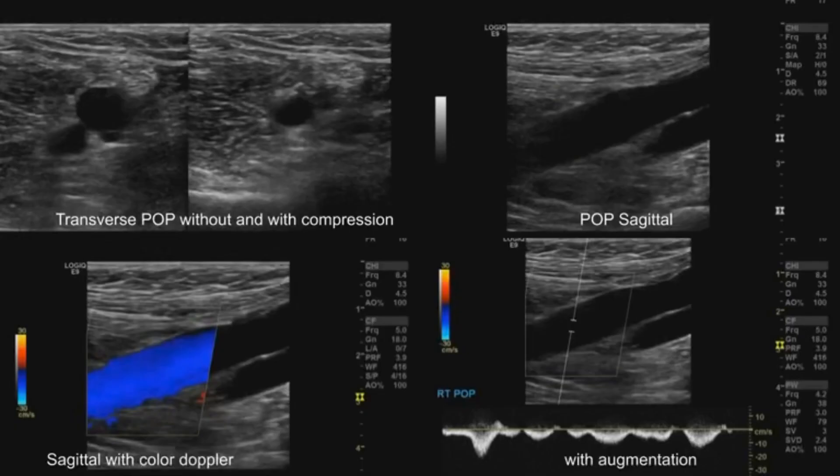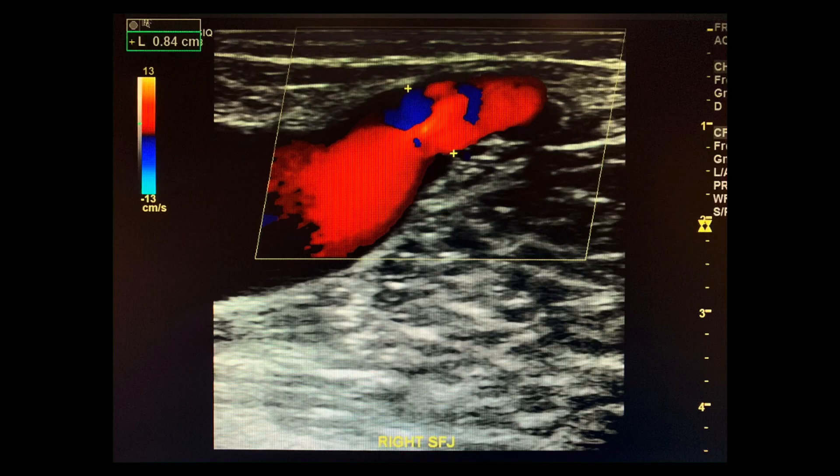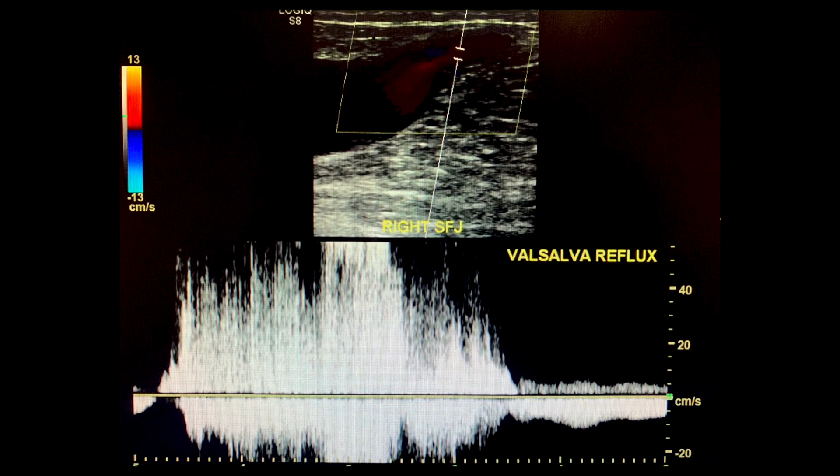Once it's clear there's no DVT, you can go on to the saphenofemoral junction located in the groin. Take grayscale and colored Doppler images, measure the diameter, then perform spectral tracings with Valsalva maneuver. If there are incompetent valves, the Valsalva maneuver will cause reflux of flow. A reflux greater than 0.5 seconds will be a positive finding. In substitution for Valsalva, you can also use a distal augmentation to elicit the reflux.